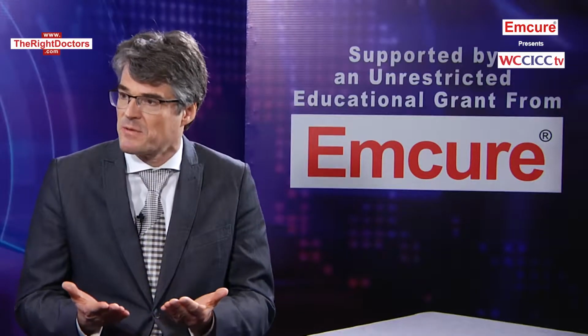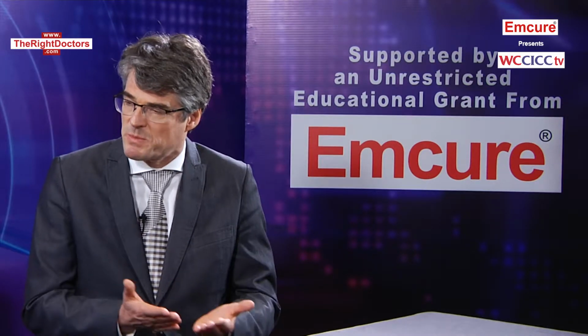And with MR, what we can see after the invasive angiography is that a lot of them actually have myocarditis. So they have an inflammation of the myocardium, which we can detect very nicely with MR. So both groups, before invasive angiography or after invasive angiography, are strong indications for doing a cardiac MR test.